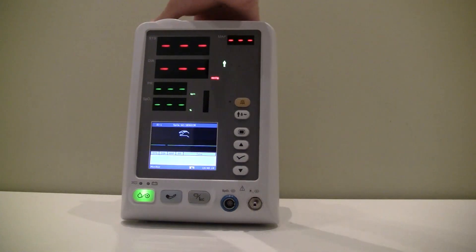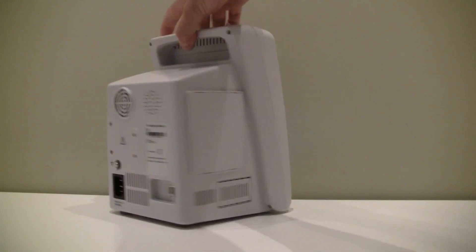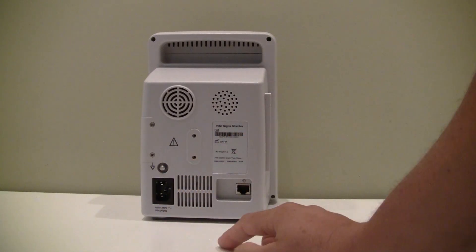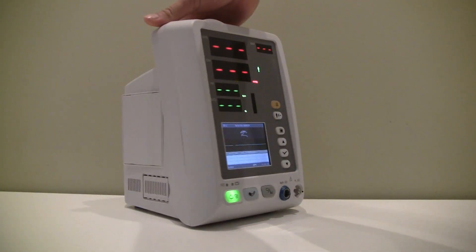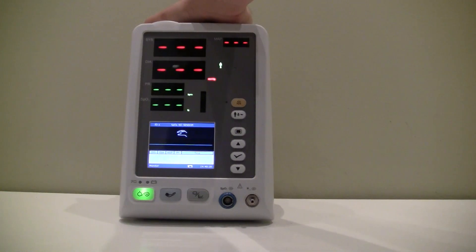This particular unit doesn't have the optional printer on it, which would go here. On the back of the unit, you can see there's a grounding port if applicable, a power supply, and an ethernet port for networking this device with the optional software — a low-cost software option to transfer data very easily to a PC.